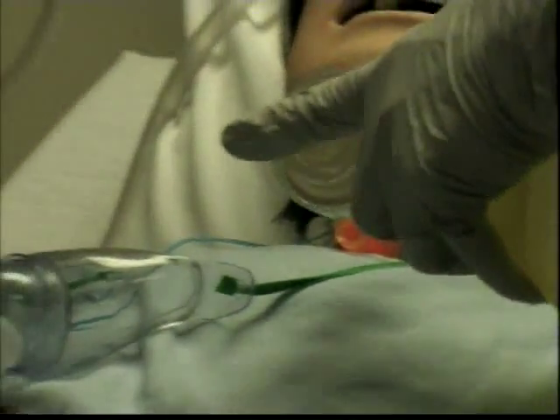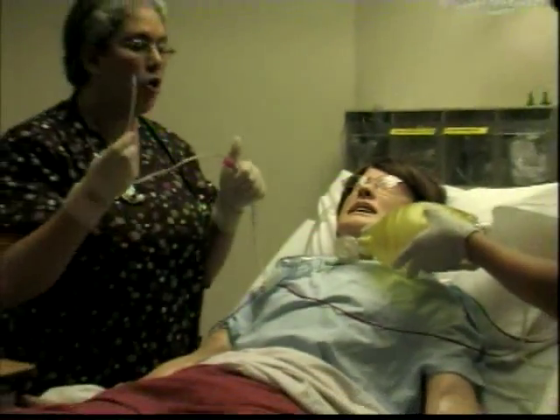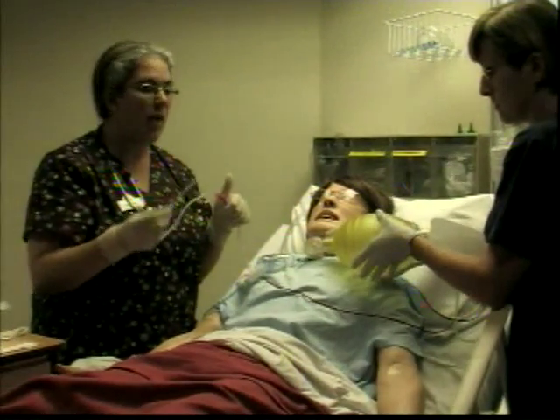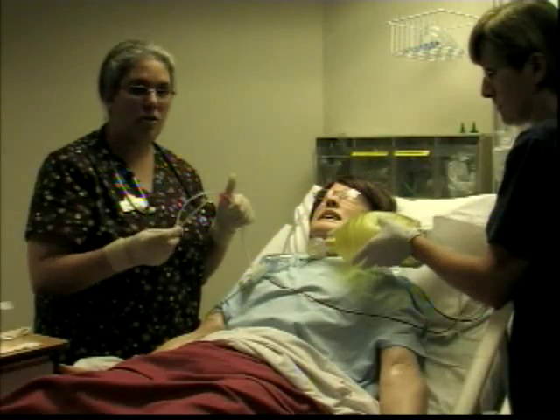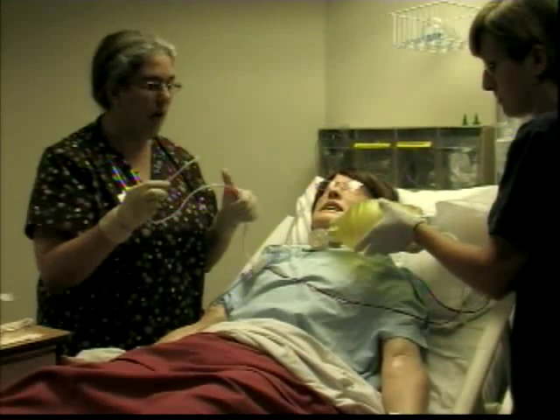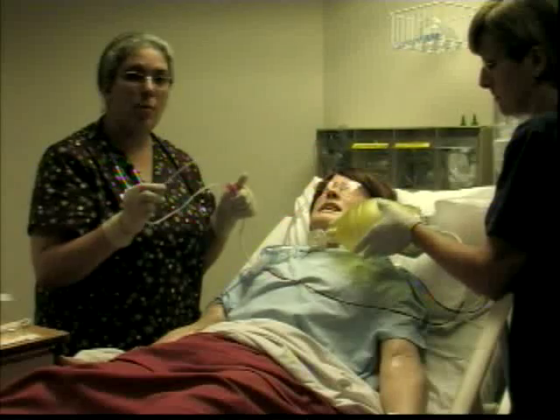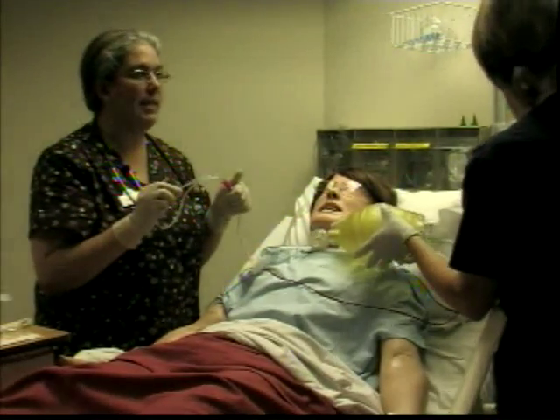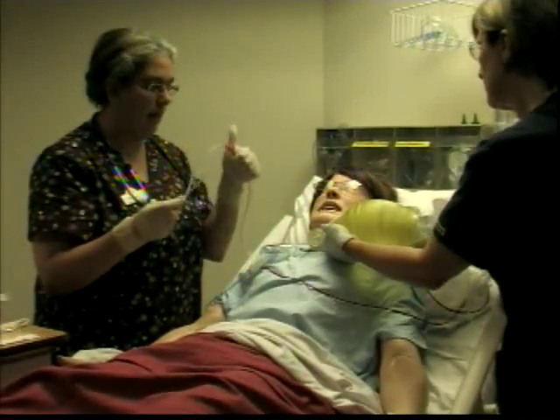And then she's going to replace the oxygen. It's going to hyperoxygenate the client. No more than 10 to 15 seconds going down, suctioning back out. And you have to allow the client time to recover and reoxygenate. Only applying suction as you are withdrawing, intermittent, and in a circular motion with the catheter. No more than 2 passes. So I'm going to allow her to come back. Her heart rate should come back down. Her pulse ox should come back up. And then I'm going to go for the second time. Thumb up.